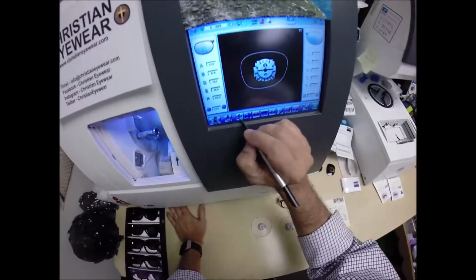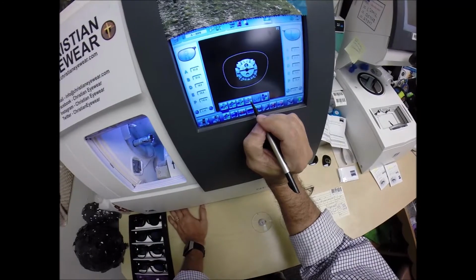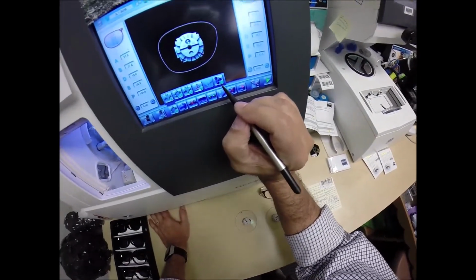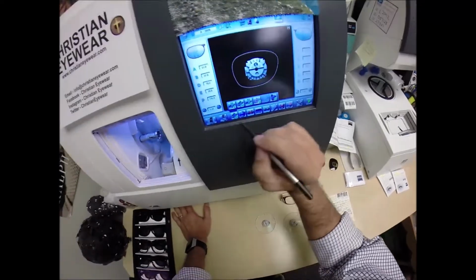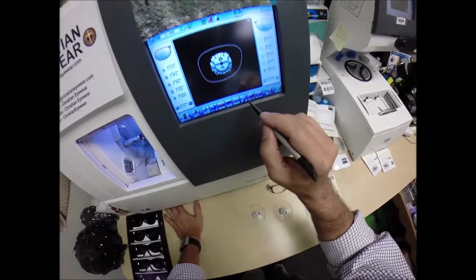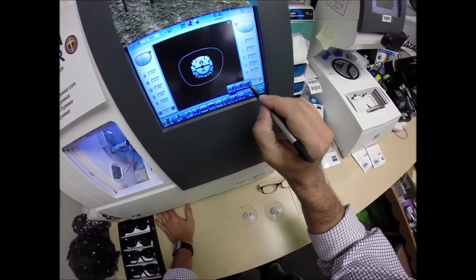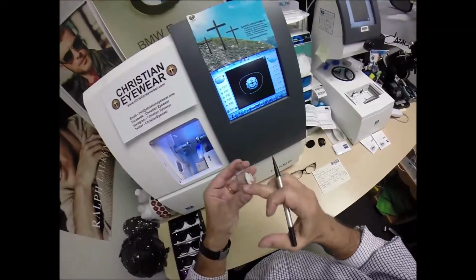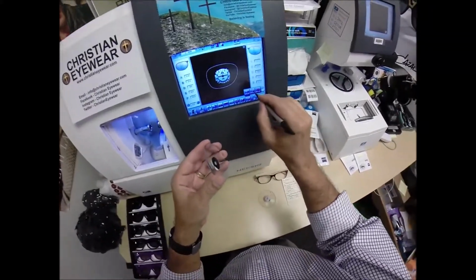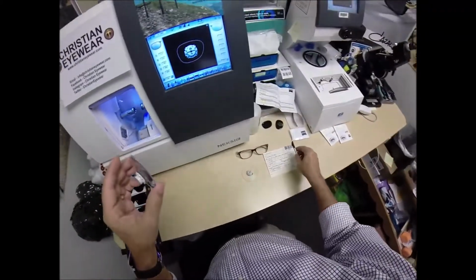But these are polycarbonate lenses. If they were plastic, high-index plastic or Trivex, I would select that material, or some space-age futuristic to-be-determined material. I can't wait till that happens in episode number 330 million. I'm not going to polish the edge of the lens. It's not going to be seen. I'm not going to put a safety bevel on the front convex surface of the lens, but I am going to place one on the rear concave surface of the lens. And that concludes your vocabulary lesson of the day.